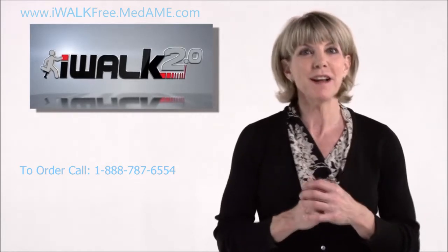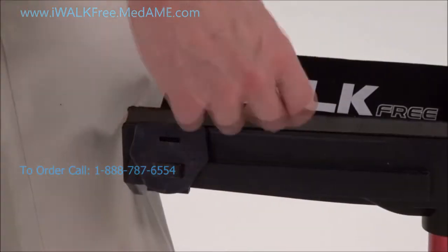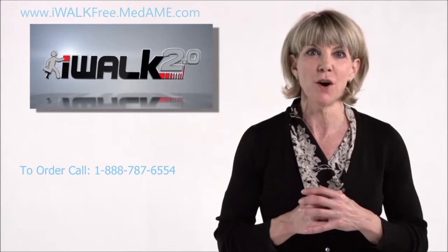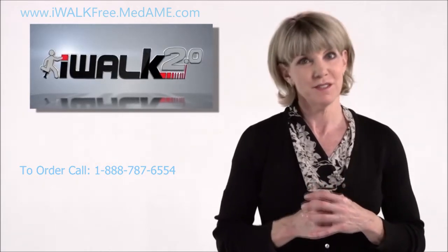Later we'll raise it a bit, but for now tighten the clamp bolt and check the height. Make sure the spring heads are fully engaged in the holes, otherwise the crutch can collapse when you put weight on it.